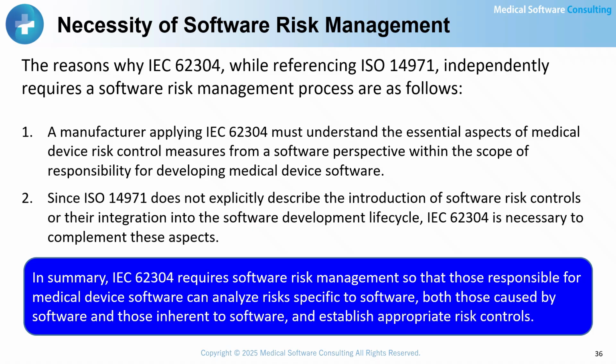Therefore, IEC 62304 is needed to supplement these aspects. In summary, IEC 62304 requires software risk management so that those familiar with medical device software can analyze risks both caused by software and specific to software and apply appropriate risk controls.